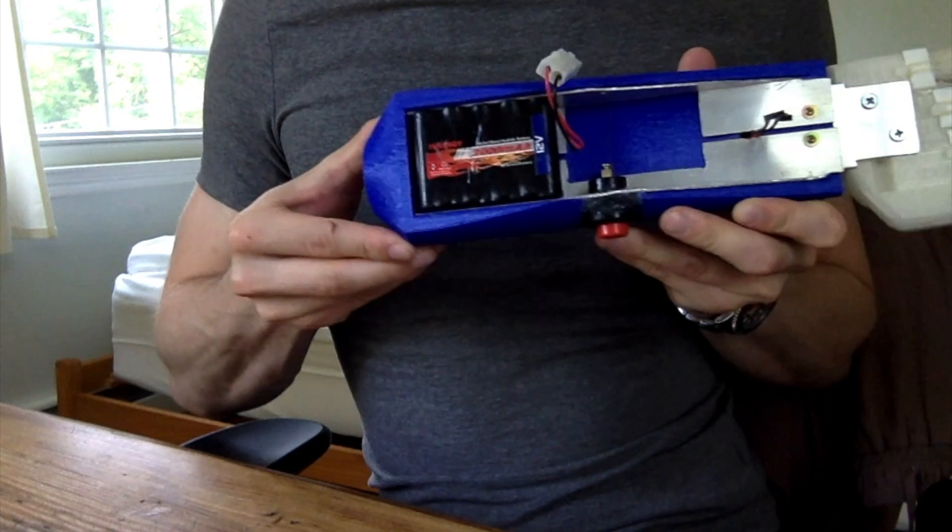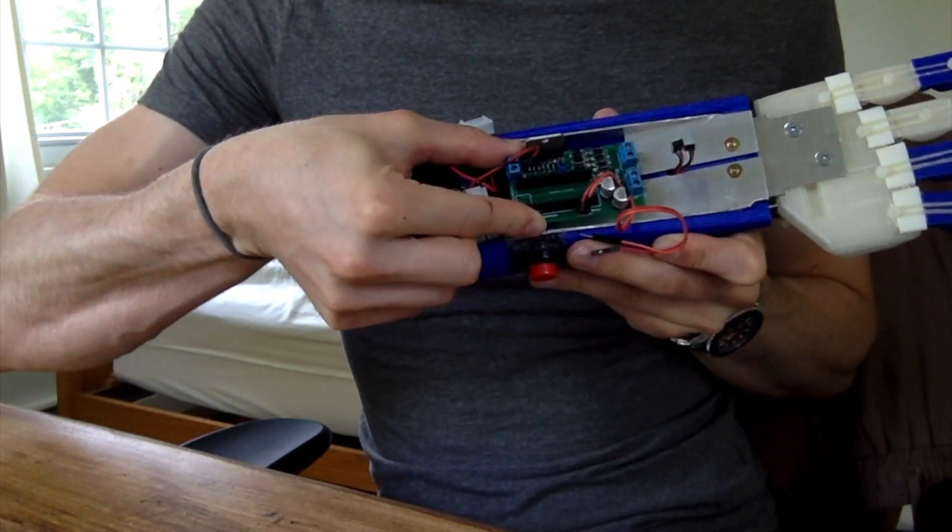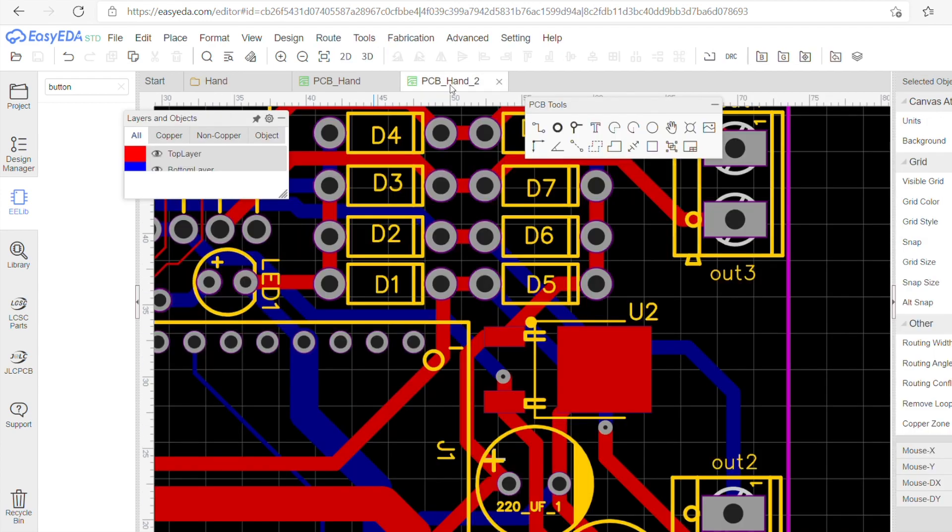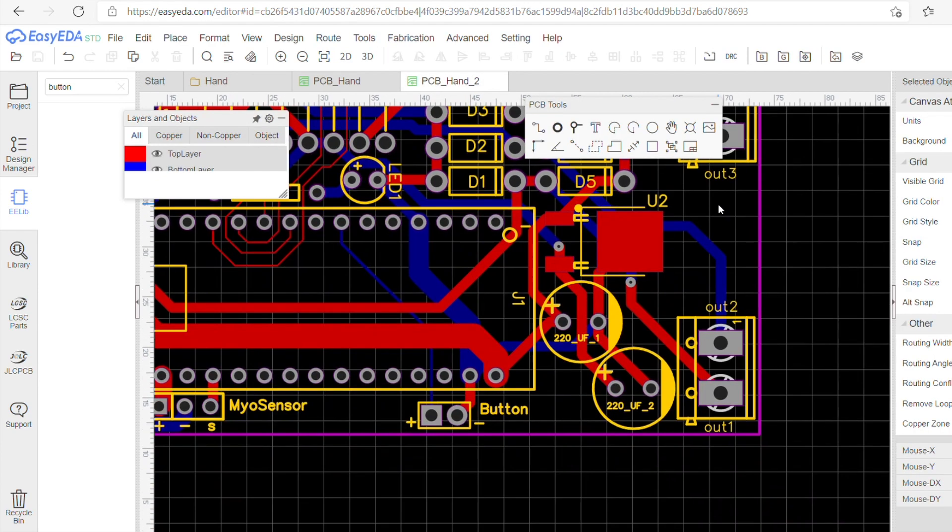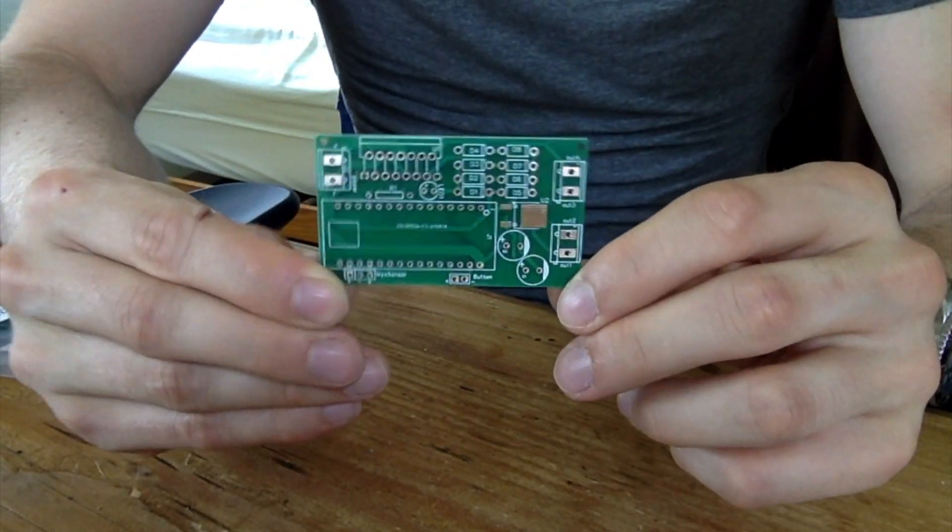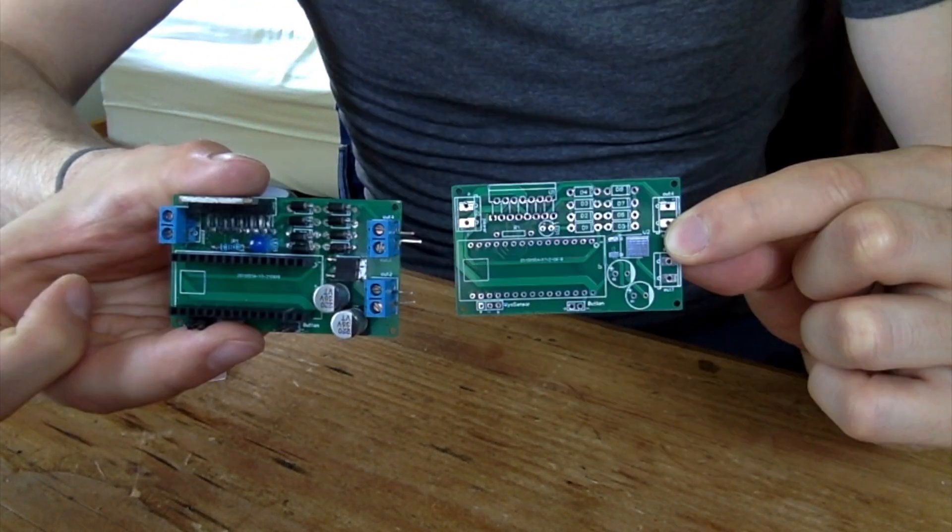I reduced the electronics down to a single custom circuit board, which fits here. I designed the circuit using EasyEDA, then created a board layout and sent the Gerber files to JLCPCB to get printed. They look like this when they arrived, and after soldering on all the components, we get a complete board.